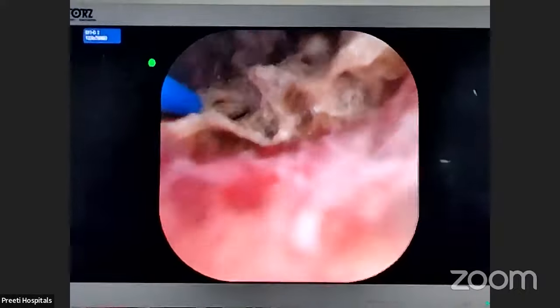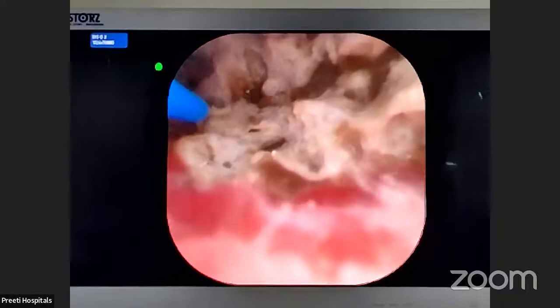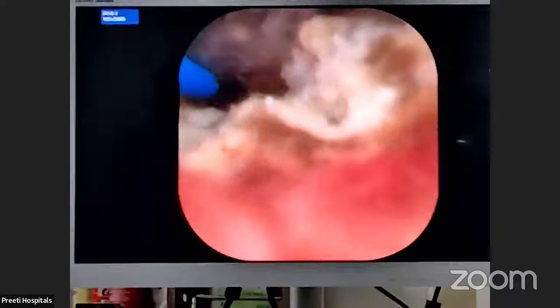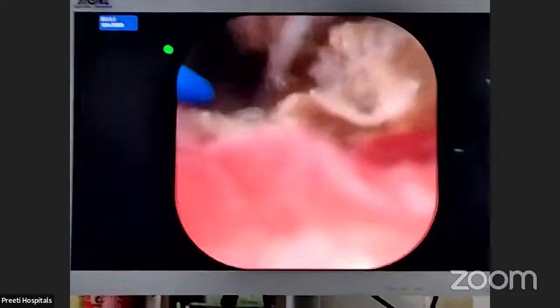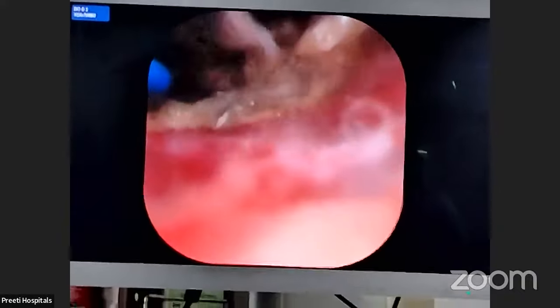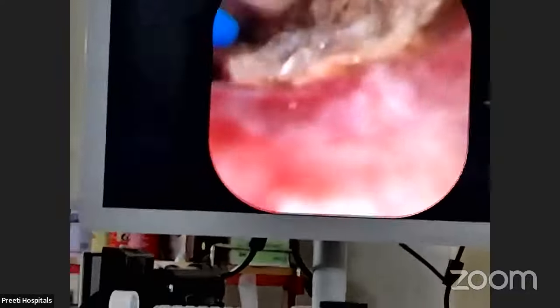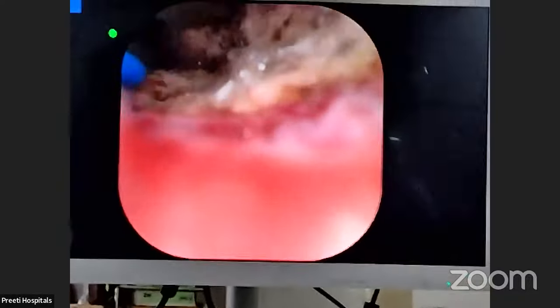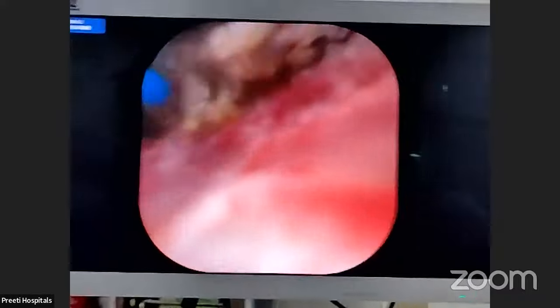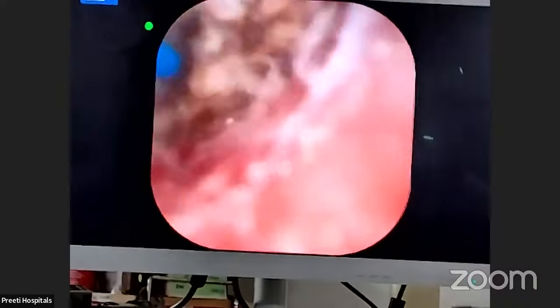First question is a very important question. The scope can get damaged if you flex the tip of the flexible scope too much. You should have experience. If it is a lower calyceal stone, I say it is very difficult. You should have your entire experience to flex that so that the flexible scope, the access sheath, and the laser fiber, all three will be flexing inside.